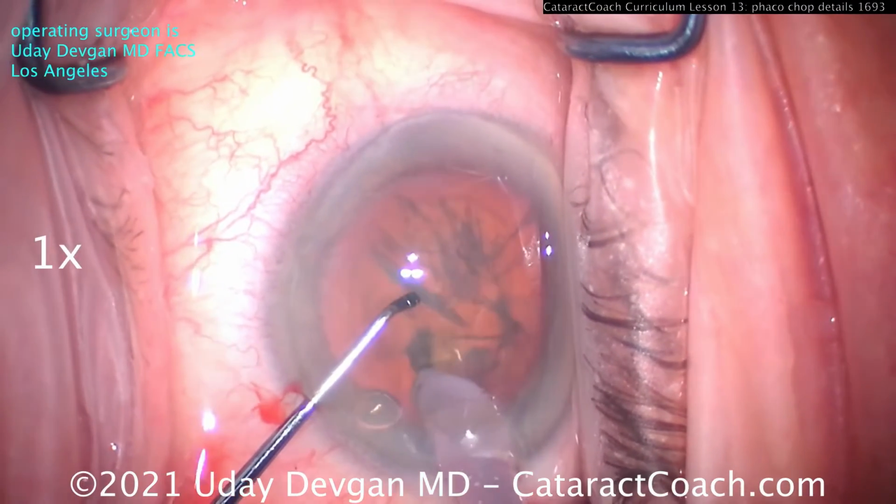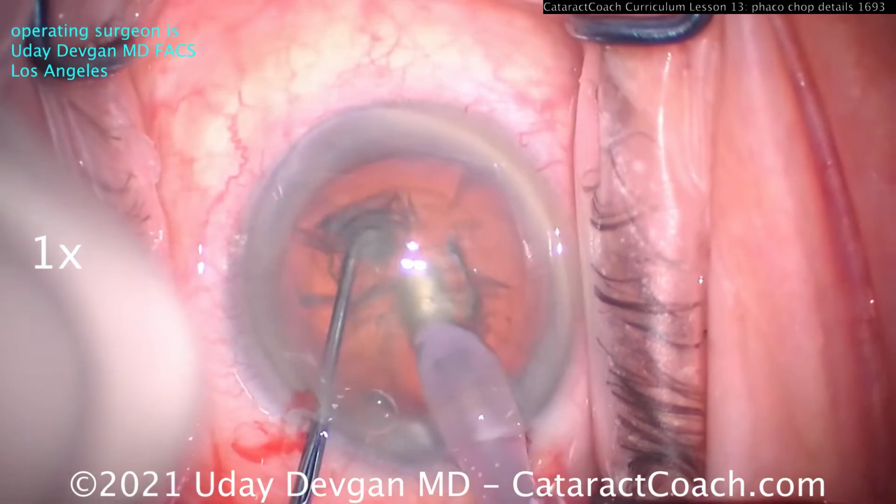Phaco probe embedded. High vacuum now. Chopper embedded. Instruments come together.